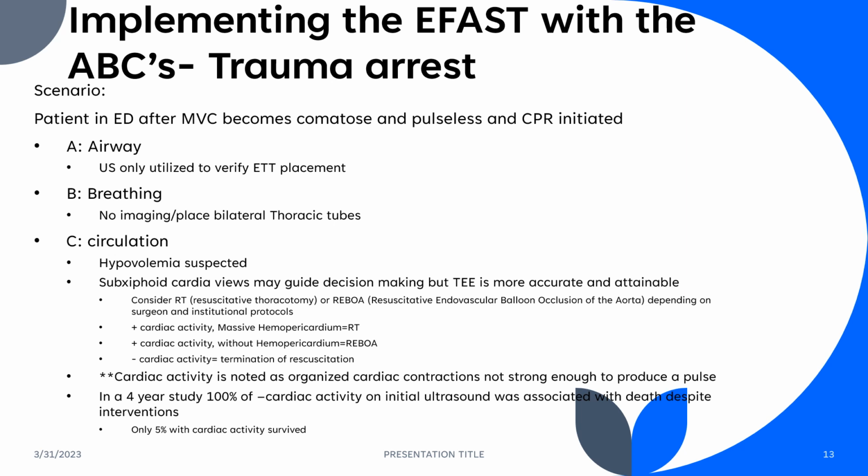And so they did provide the context of why that is the recommendation, and they had done a 4-year study where they found that 100% of negative cardiac activity on that initial ultrasound was associated with death despite any additional interventions. Only 5% that had cardiac activity identified in this situation survived, and they were treated with the resuscitative thoracotomy or the REBOA. So at this point, this patient's in a serious, dire situation, and utilizing your sonographic assessment can help you make some of those very difficult decisions.